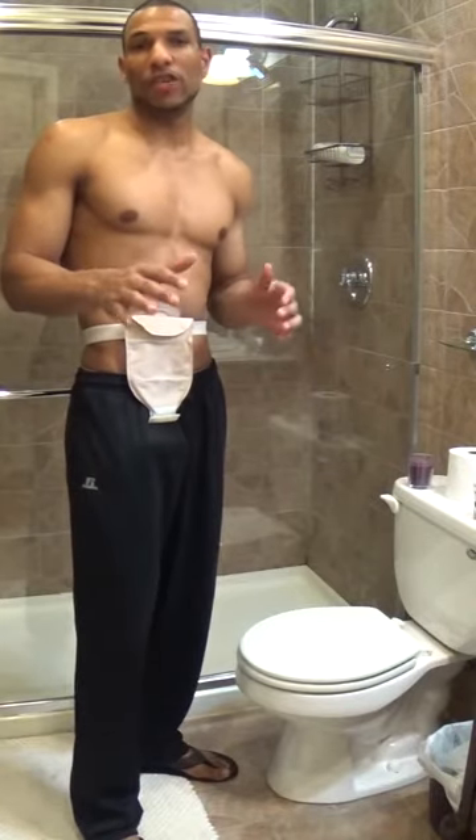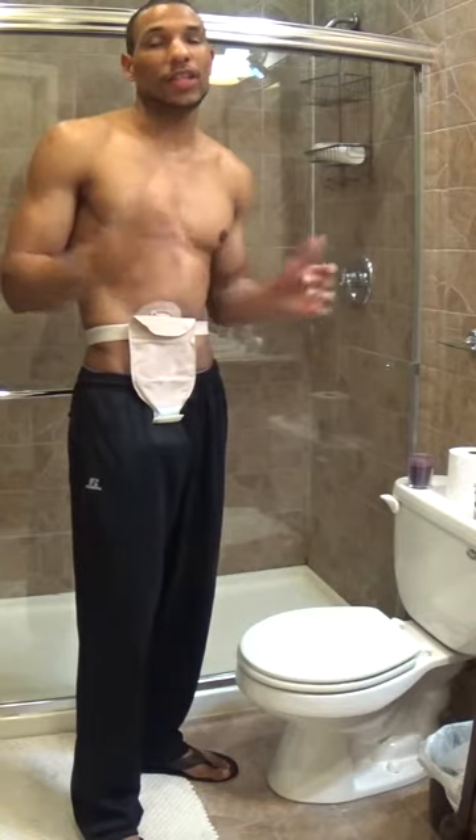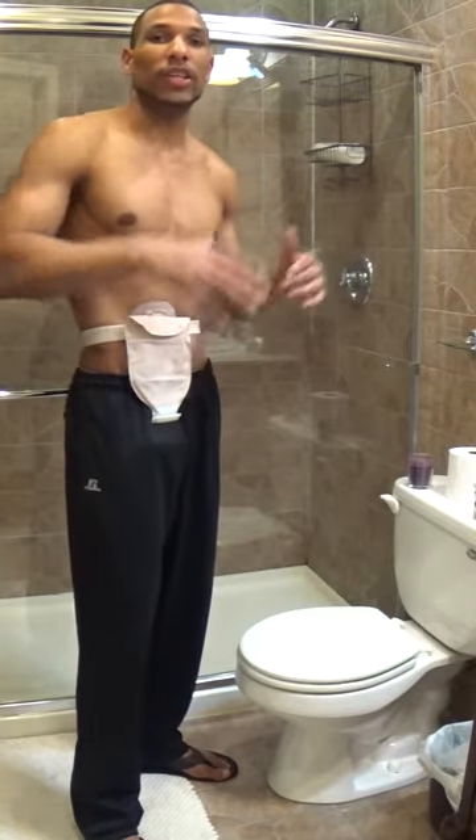Hey everyone, today's video I'm going to show you how to empty your ostomy bag, clean it, quick and easy, without getting your clothes dirty, whether you're inside your own home or if you're outside in a public restroom.